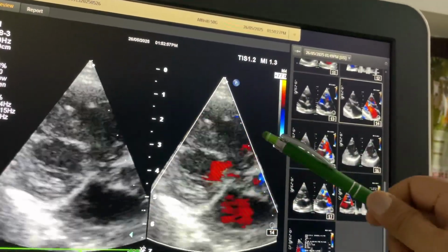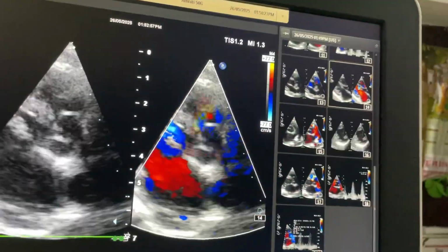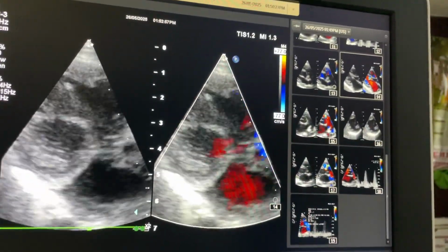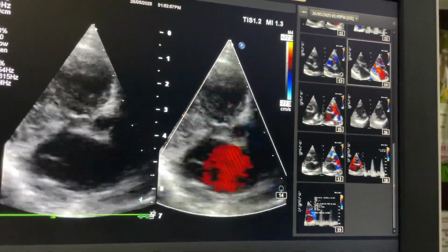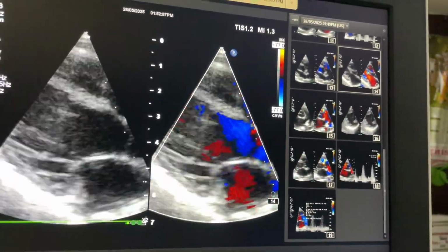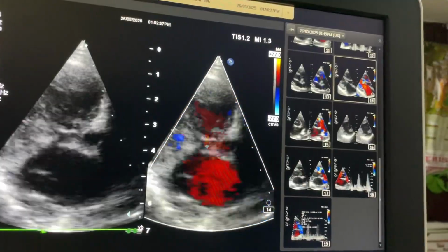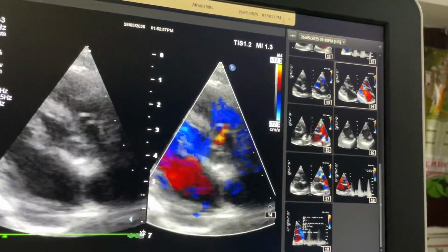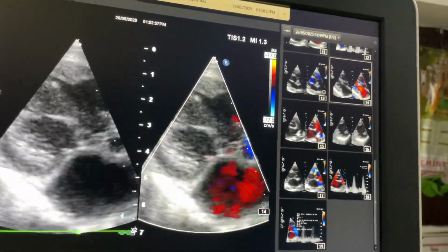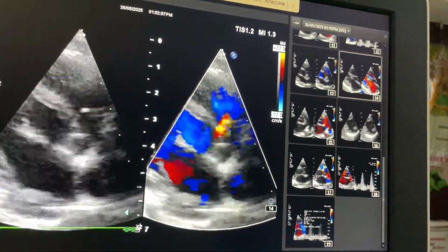If it becomes better on the right ventricle outlet view, that means it is doubly committed VSD, or outlet supracristal VSD, you can say. That is a point to know. In the typical parasternal long axis view, if you simply angulate the probe towards the tricuspid valve and the VSD becomes better, more visible, then it is perimembranous. If you angulate the probe towards the pulmonary valve, that is the right ventricle outlet view, and the VSD becomes better, more visible, that means this is doubly committed VSD. That's the point. This is parasternal long axis view.